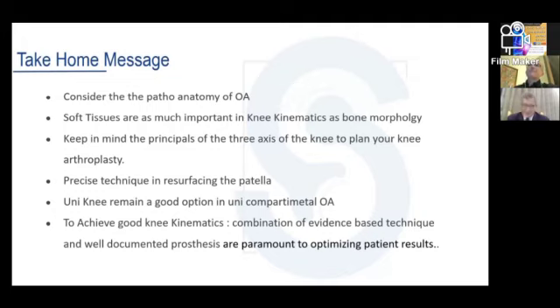Thank you. Okay, Dr. Ahmed, any other questions about the high flex? The high flex is a modification of the posterior condyle with better roll back, and you can flex more. Then the posterior cut is more important, thicker. When you put a high flex knee, if the soft tissues are stiff and the patient has been praying for 10 years on a chair, and he wants the prosthesis to let him kneel normally, it will be very difficult.